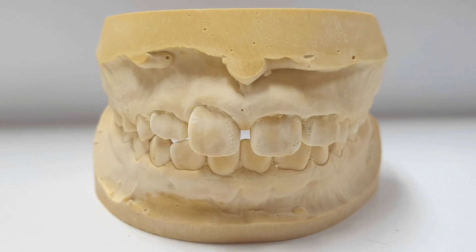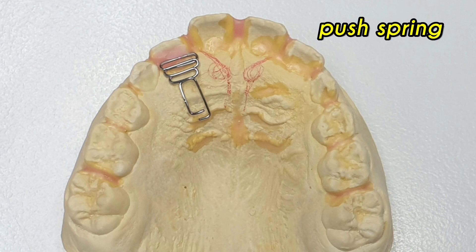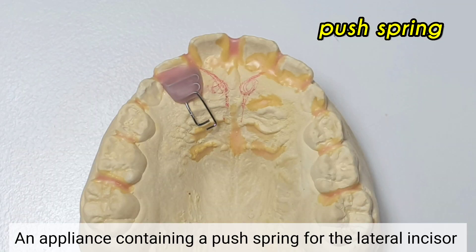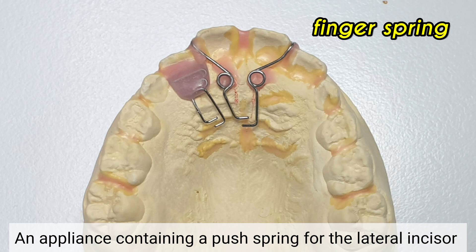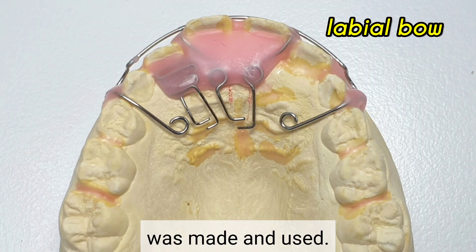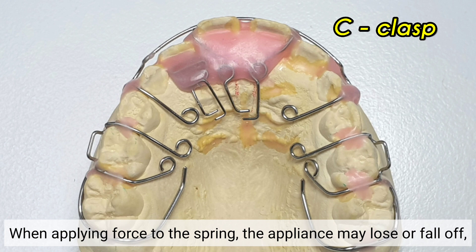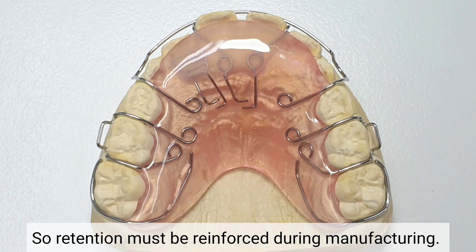Going back to the case, the lateral incisor fell out and the No.12 lateral incisor also became lingually positioned. An appliance containing a push spring for the lateral incisor and a finger spring for the left and right central incisors was made and used. When applying force to the spring initially, the appliance may loosen or come off, so retention must be reinforced during manufacturing.